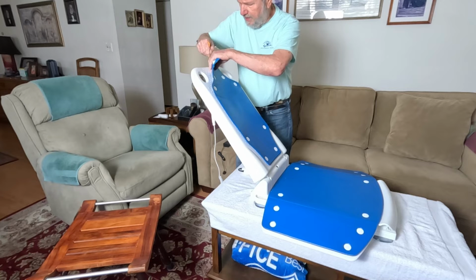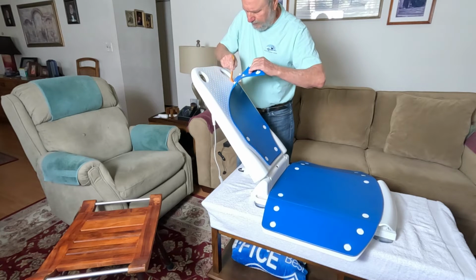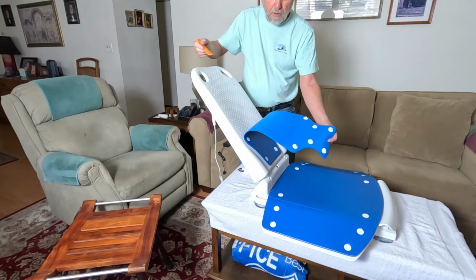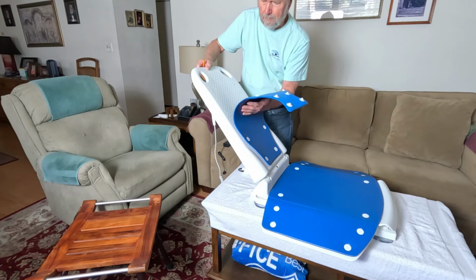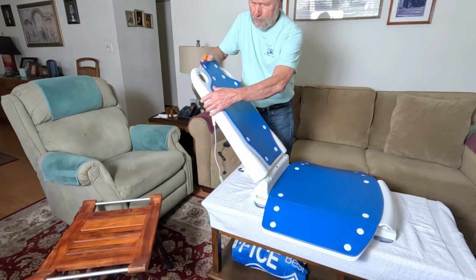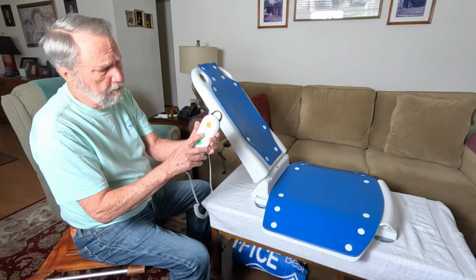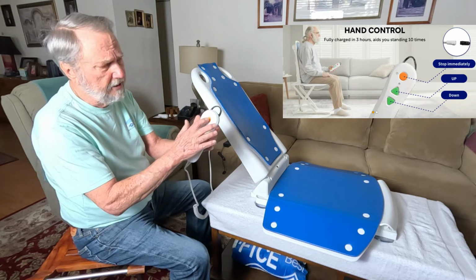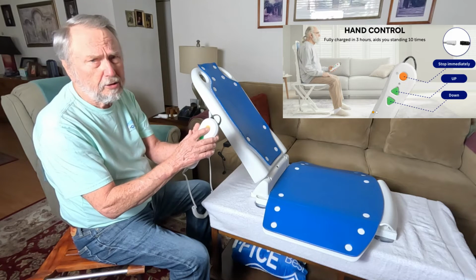And so you can take this off just like that, and just keep on going and take all of them off and clean it real good, so that that'll work well. And it's easy to go right back on. This is up, this is down, and this is an emergency stop. If something happened, it kills the power.